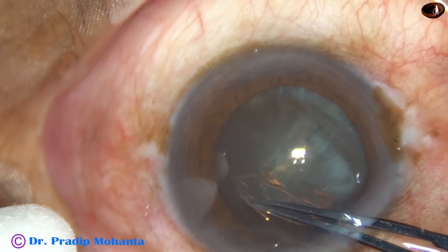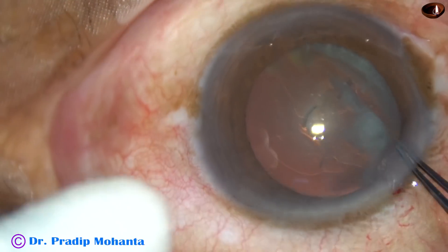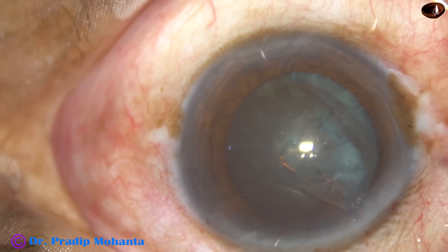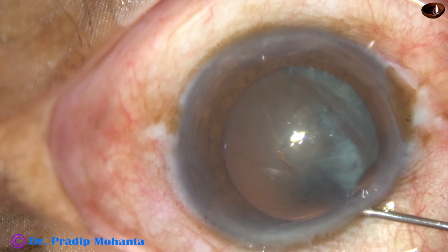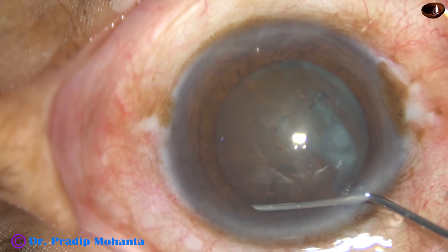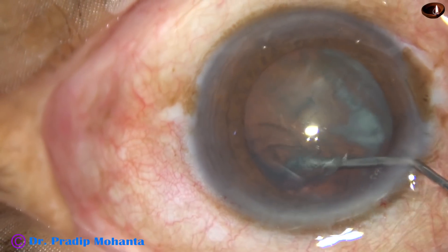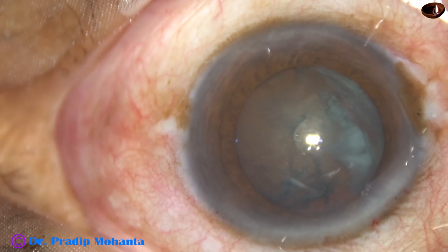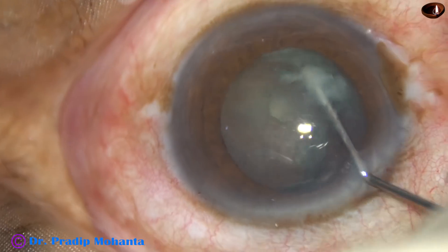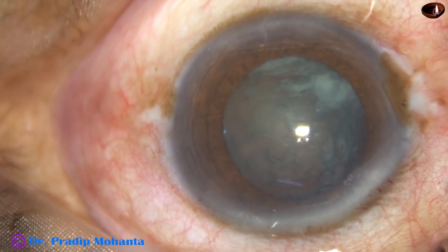Always keep an upward thrust on the anterior lip of the main incision to minimize leakage of visco that you have used. Now hydrodissection — a 27-gauge cannula, BSS, and a 2 cc syringe is used for hydrodissection. The nucleus is mobilized.